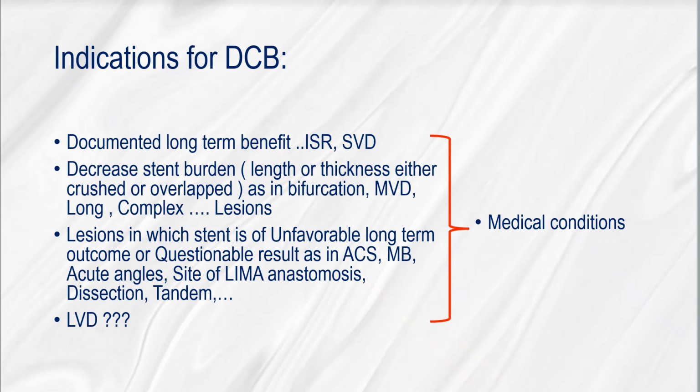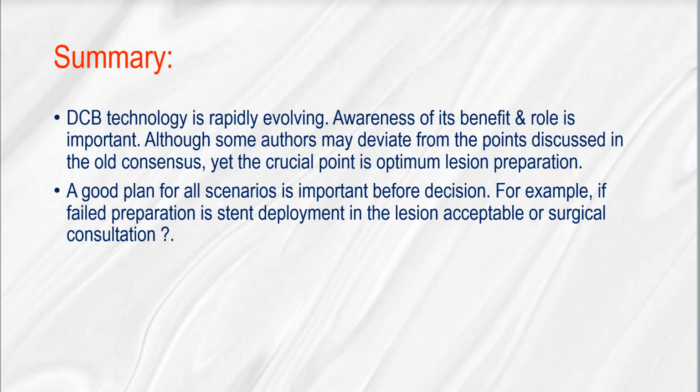Clinical indications for drug-coated balloon dilatation are either documented or rapidly evolving and will be discussed in later videos. In summary, drug-coated balloon technology is rapidly evolving. Awareness of its benefit and role is important, although some authors may deviate from the points discussed in the old consensus, yet the crucial point is optimum lesion preparation. A good plan for all scenarios is important before decision. For example, if failed preparation, is stent deployment in the lesion acceptable, or surgical consultation?